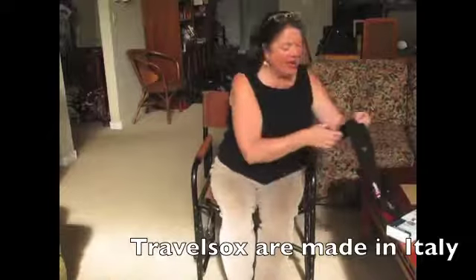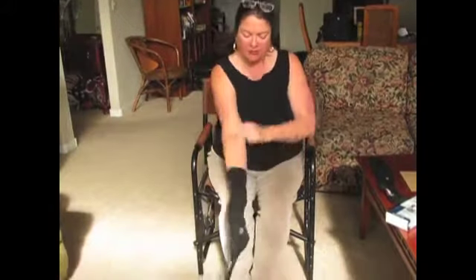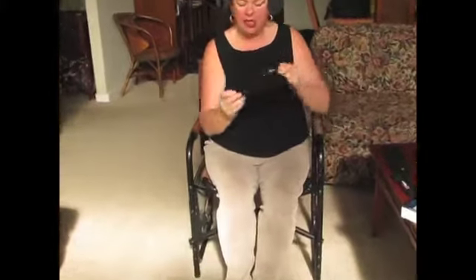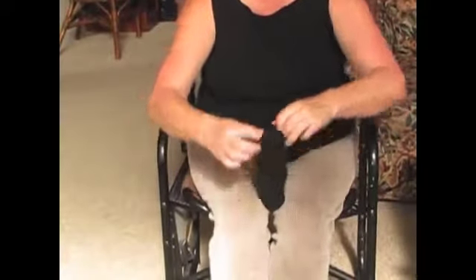Today I'd like to show you how to put on a travel sock. First, you want to stick your arm in all the way through, and it's going to go up your arm just like a sleeve. You're going to pinch the heel, pull it back through, and then that's going to give you a spot to start your toe, and that's how we're going to put on the travel sock.